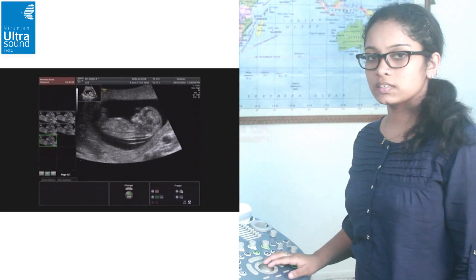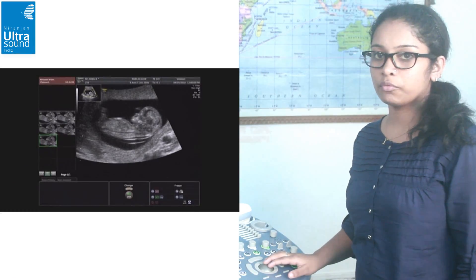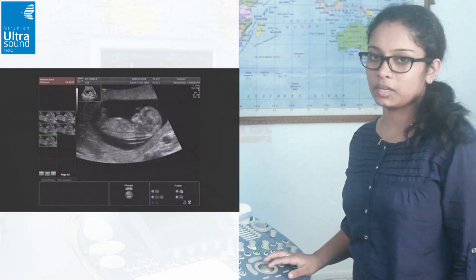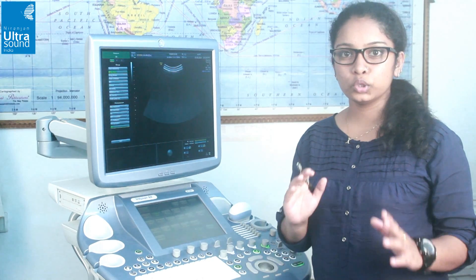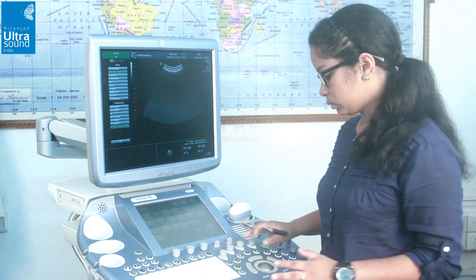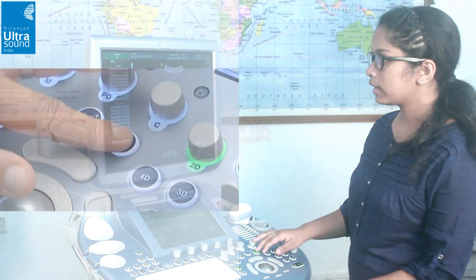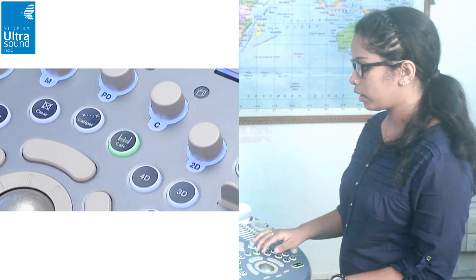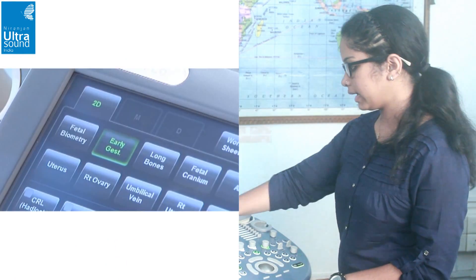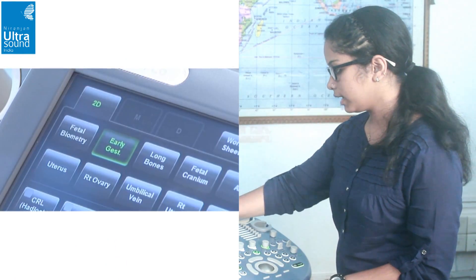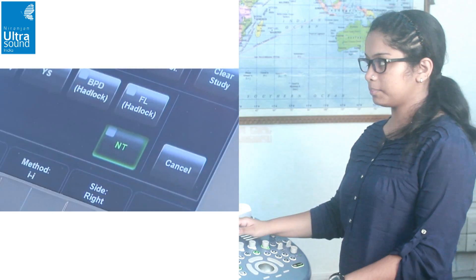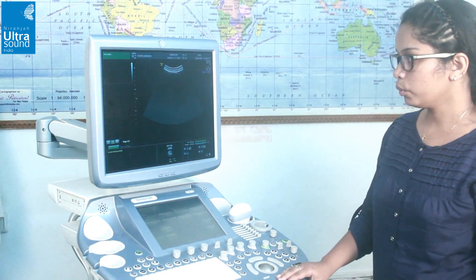The NT measurement is carried out on the frozen 2D image. In order to do so, we go to the calculation tool and then select early pregnancy and then NT measurement.